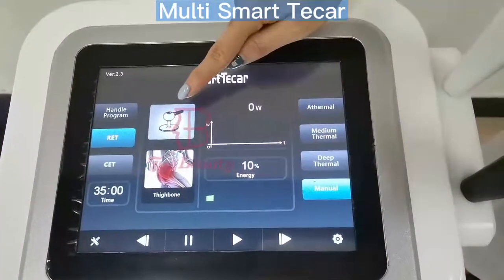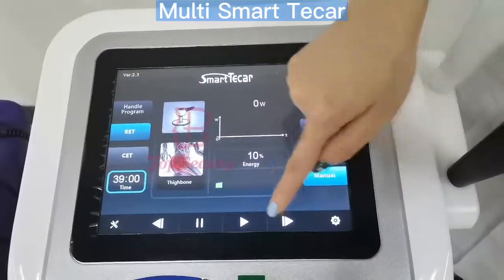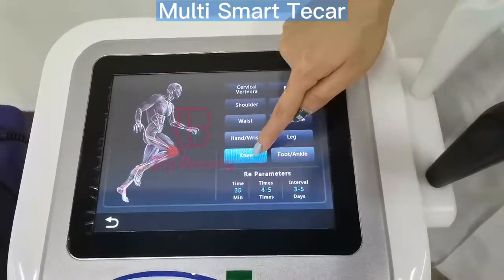This is the double RET handles. We can also set the working times, energy setting, four different modes, and 10 treatment areas.